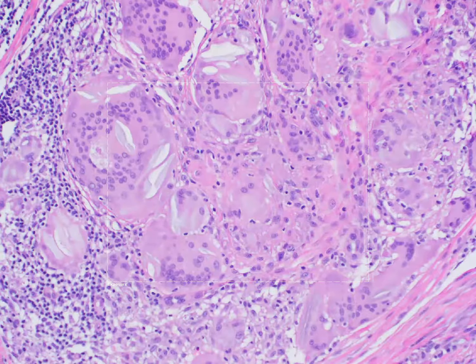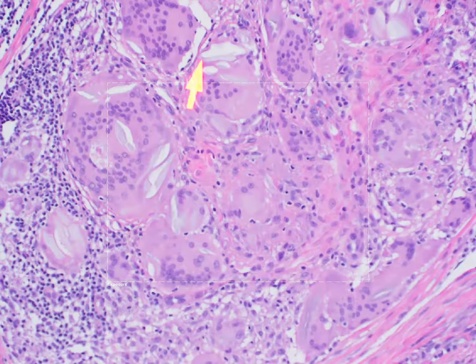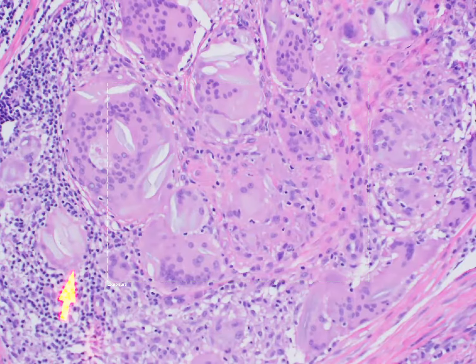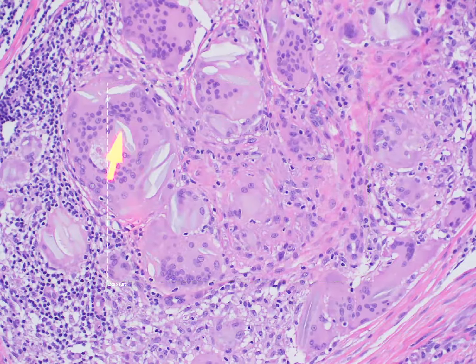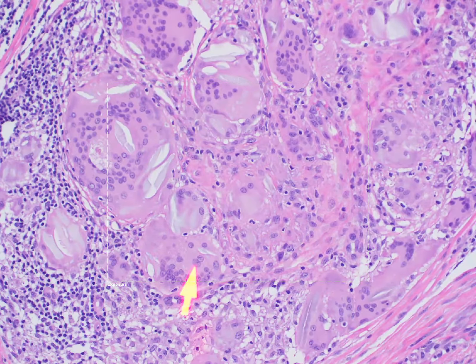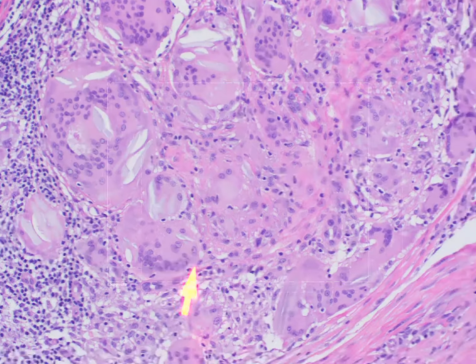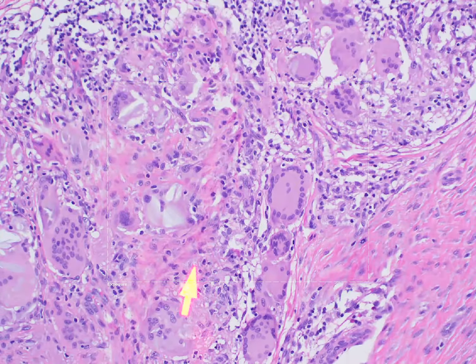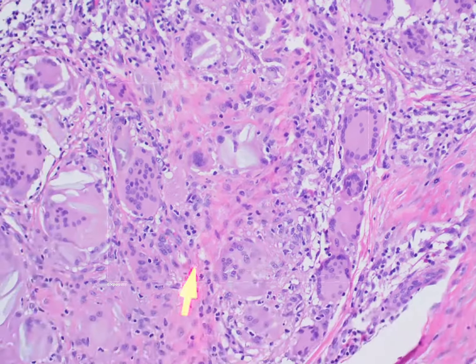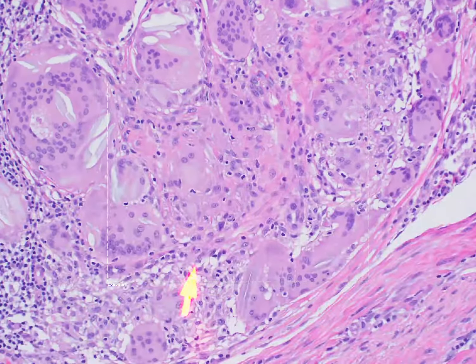If we go in on higher power, I wanted to show you what these are comprised of. These are multinucleated giant cells with multiple nuclei, and they have this blue-gray material that they've engulfed in their cytoplasm. Whenever you see epithelioid histiocytes or multinucleated giant cells like this, these cells exist to clean up debris. They clean up the tissue, and they ingest exogenous and endogenous foreign body material.